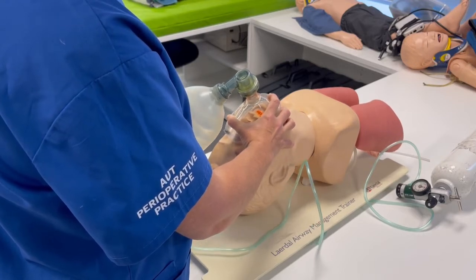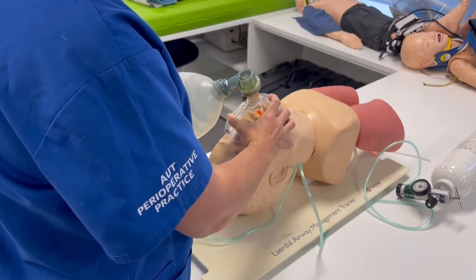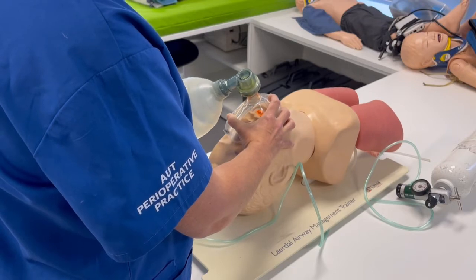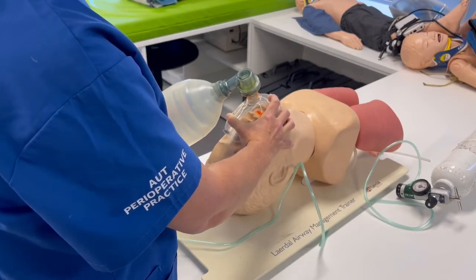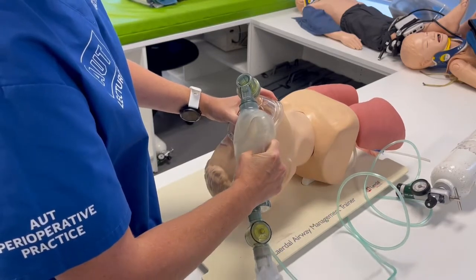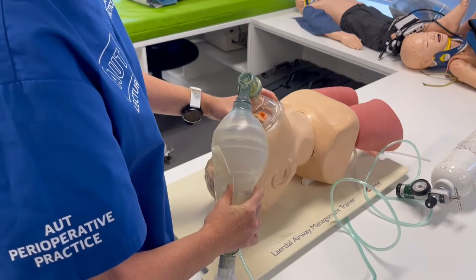We don't want short and fast squeezes — nice, gentle, slow breaths for the patient with the bag valve mask. You'll notice I'm not squeezing the bag completely, just enough to make the chest go up and down.